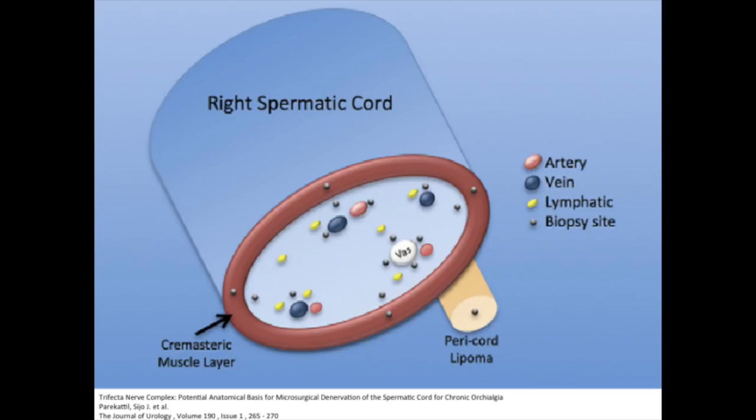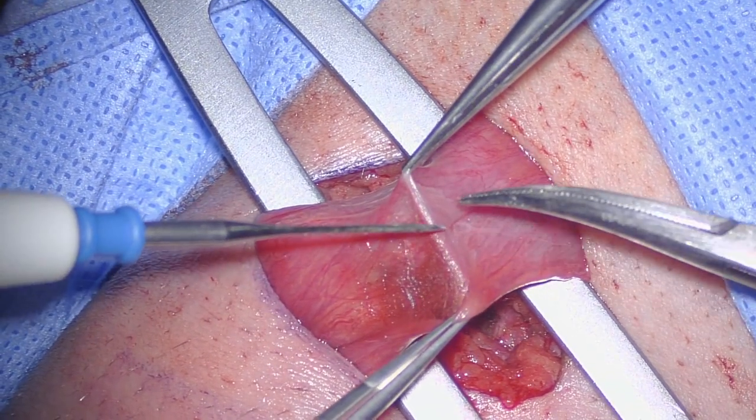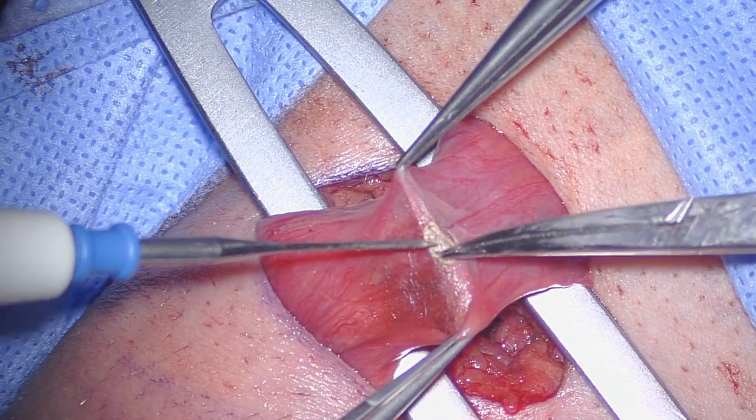Special attention is paid during this procedure to divide the trifecta nerve complex, including the perivasal complex, posterior periarterial and lipomatous complex, and the intracremasteric complex, as described by Parekattil et al. After the operating microscope is brought into the field, the cremasteric fibers are sequestered.